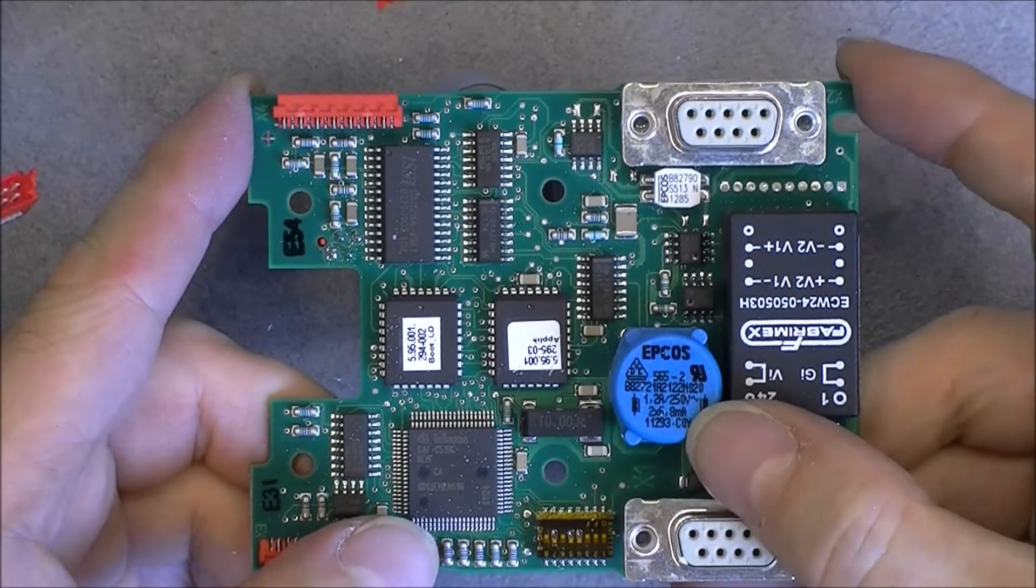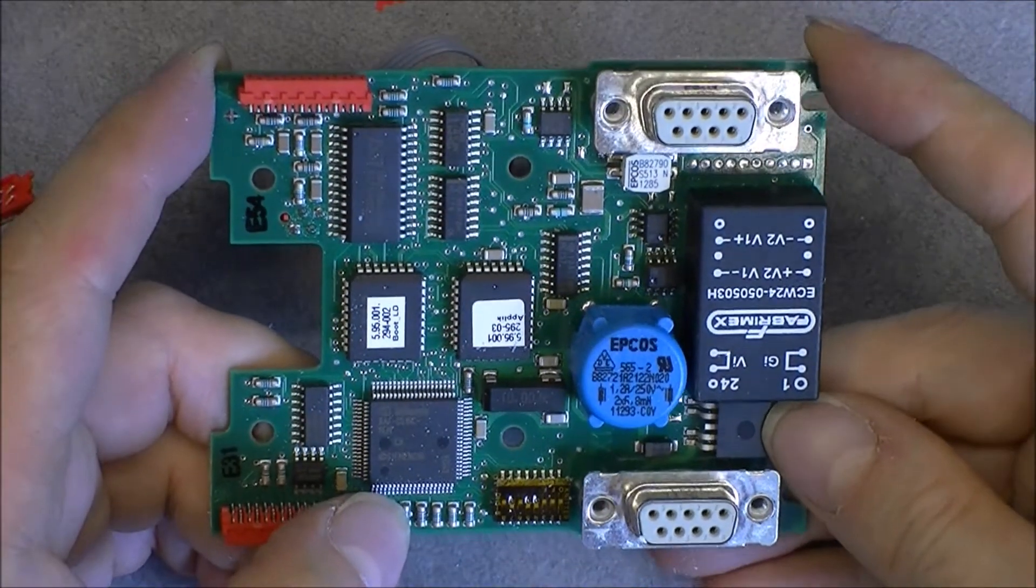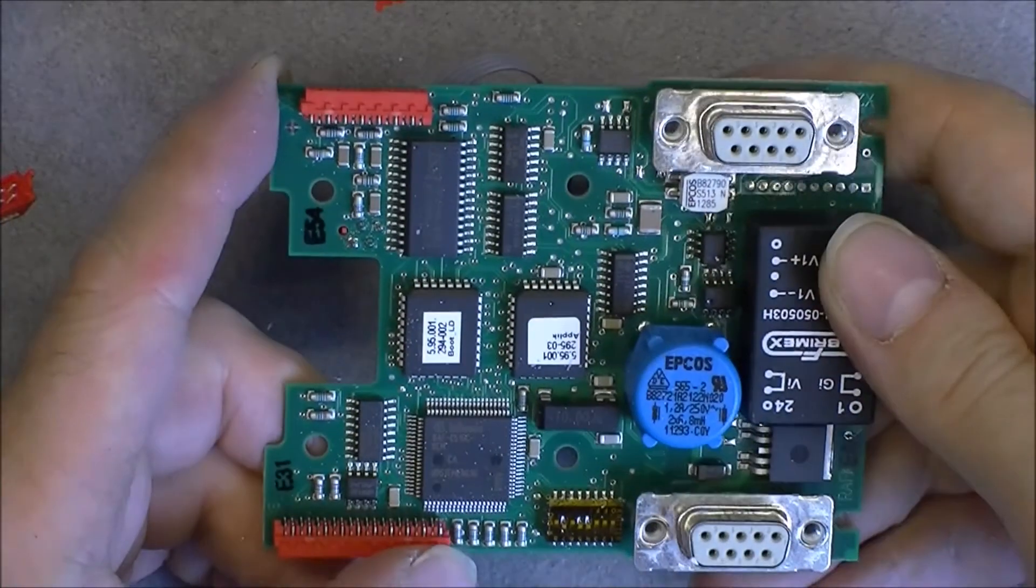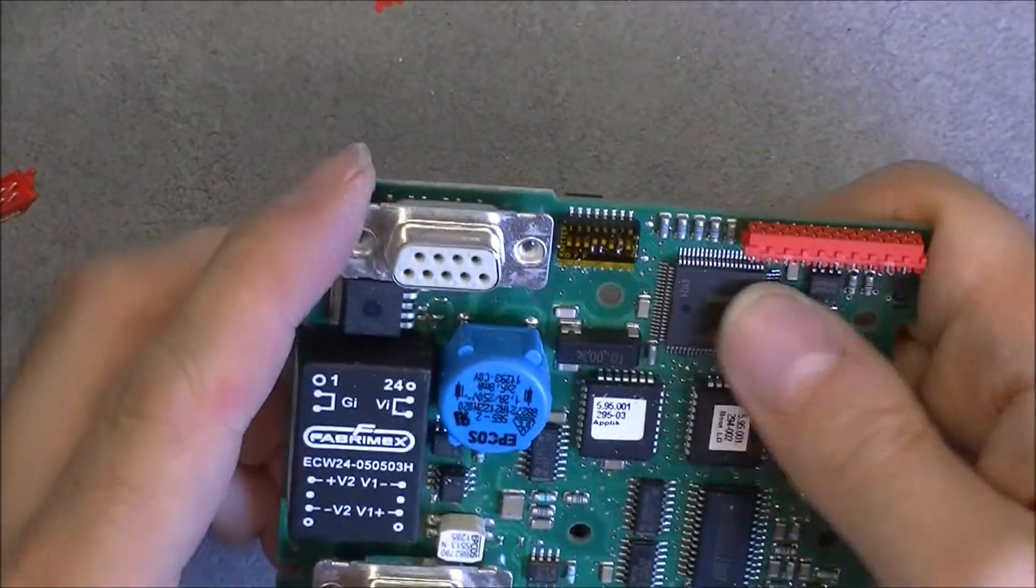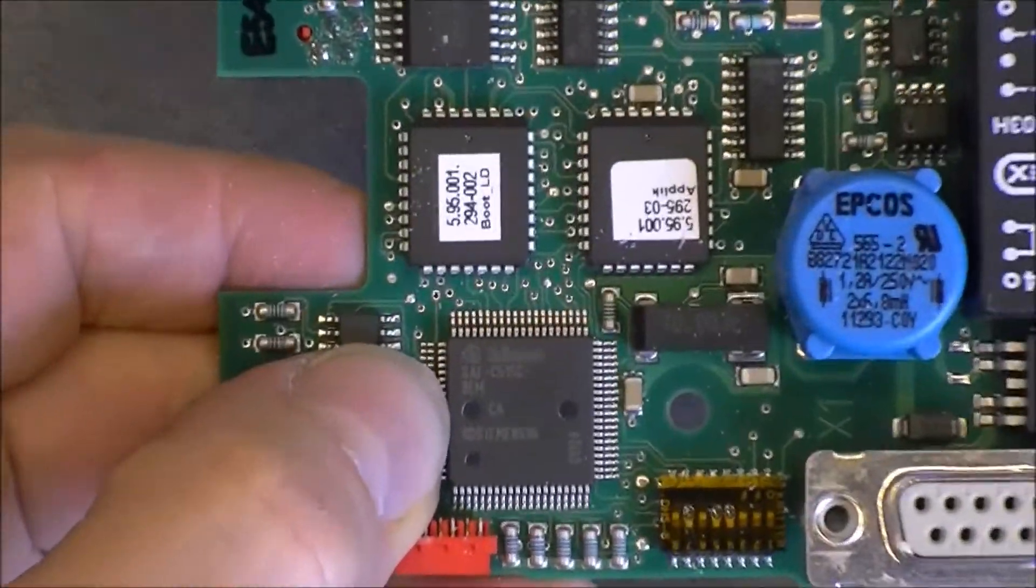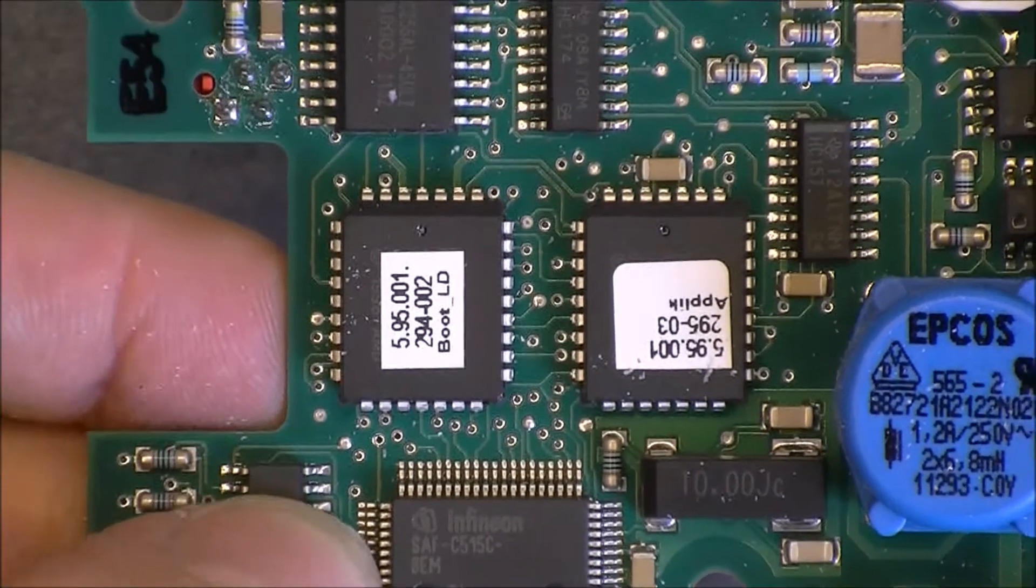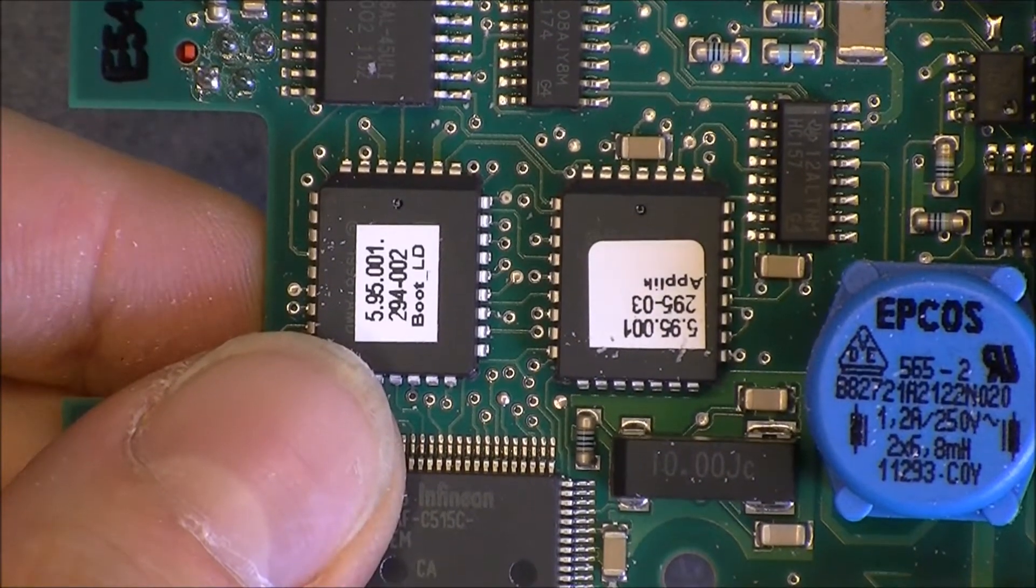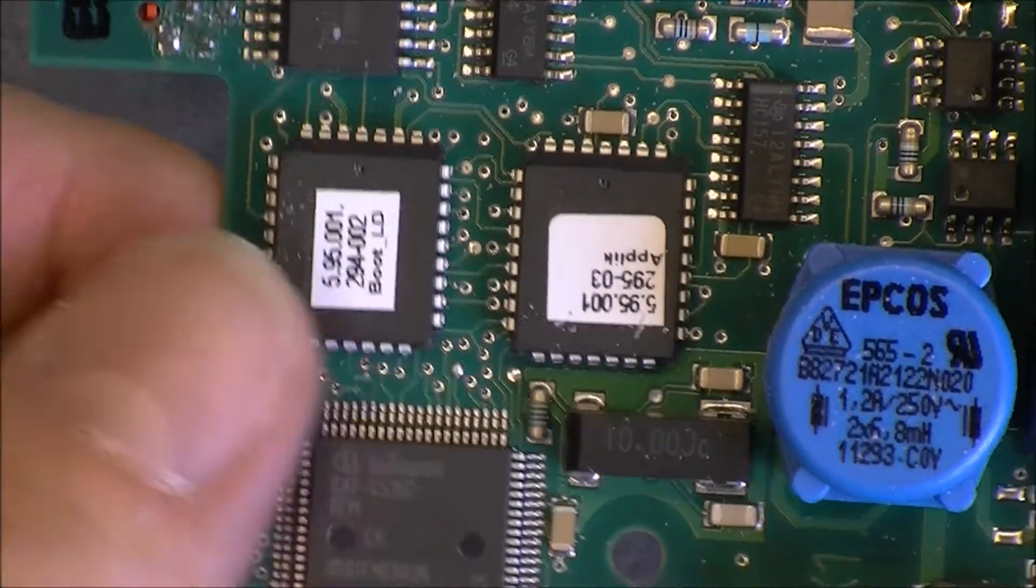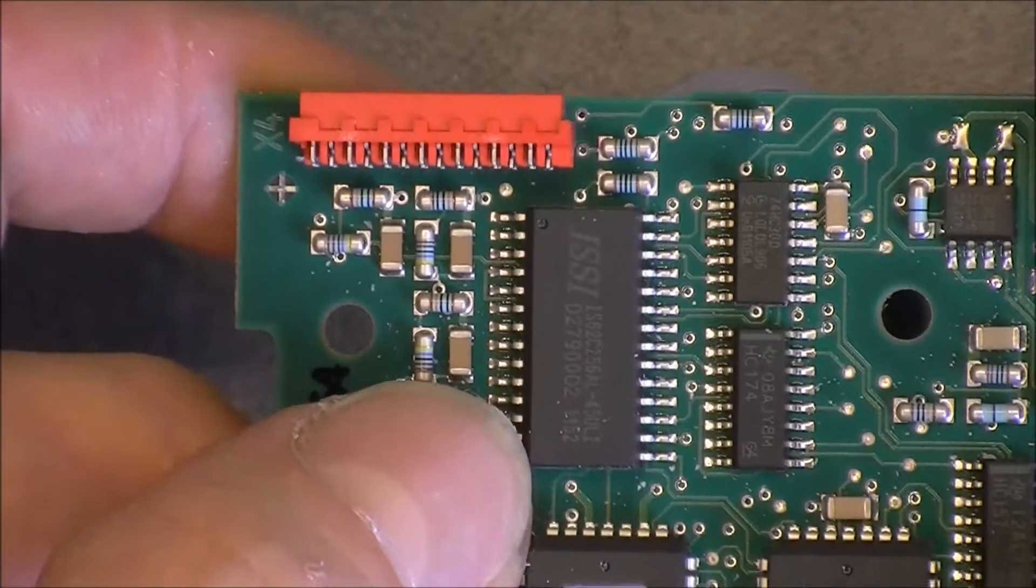A Fabrimex DC to DC power converter, some EPCOS filtering inductor, some MOSFET or voltage regulator here, one more EPCOS inductor here it seems. We have one Infineon chip, here is the model number for you.